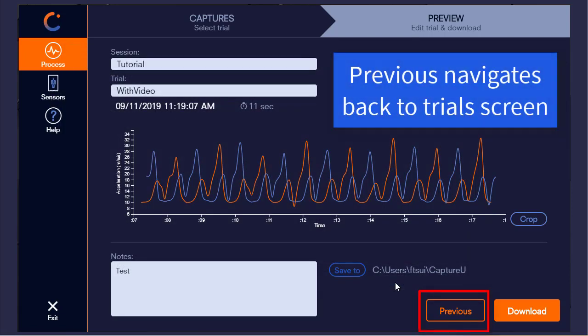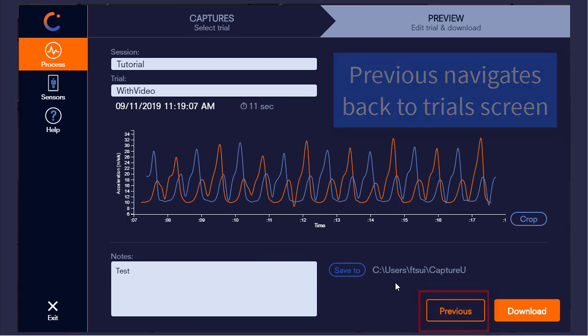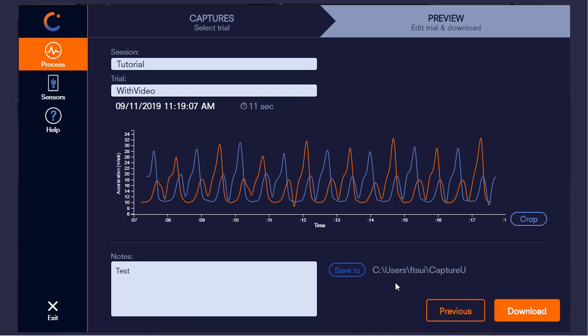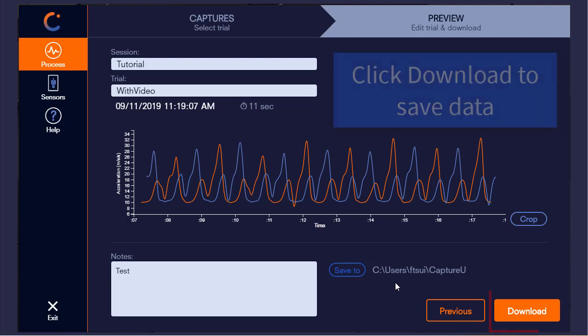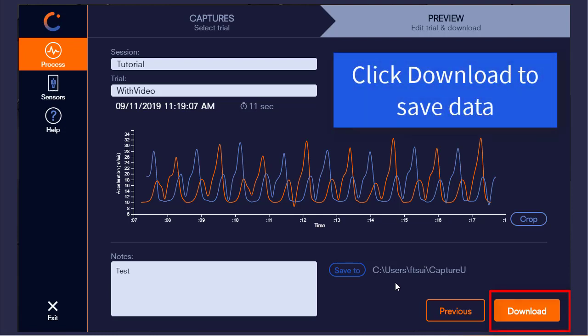The last remaining options on this screen are to either navigate back to the trial screen through the previous button or download this trial data via the download button.